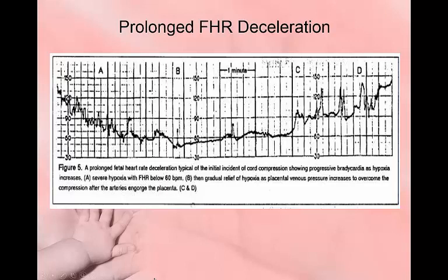Then sometimes we can see a prolonged fetal heart rate deceleration. A lot of times when we see these, they tend to be after an epidural is placed. What we're going to talk about in the intrapartum lecture is some of the common side effects of an epidural, and one of them is maternal hypotension, which can cause a prolonged fetal heart rate deceleration. So we want to make sure, certainly we've assessed mom's blood pressure if this happens, so we can make sure that that's not the cause. We want to treat any underlying causes of this.